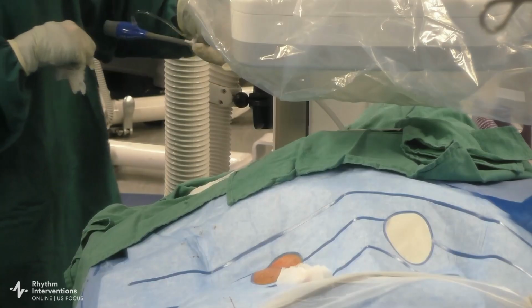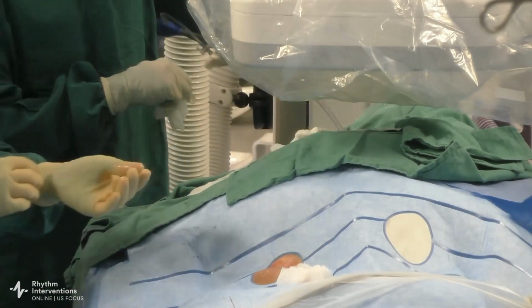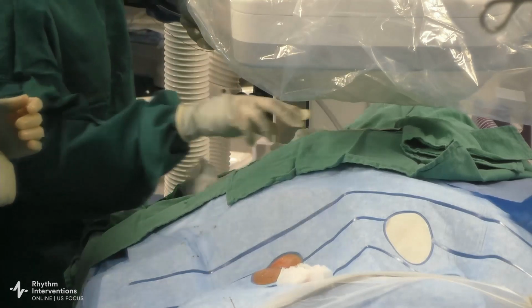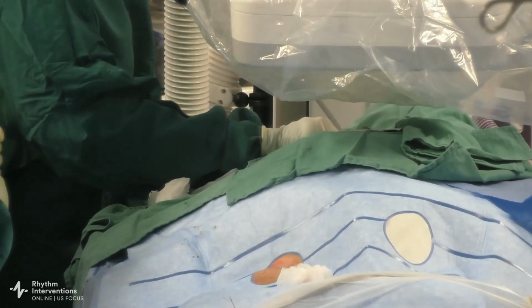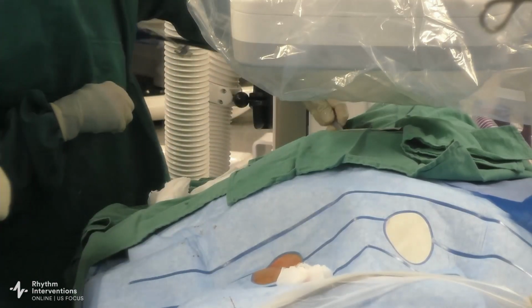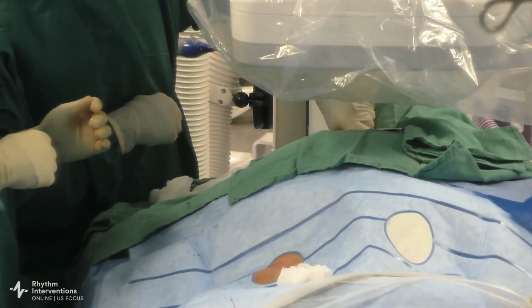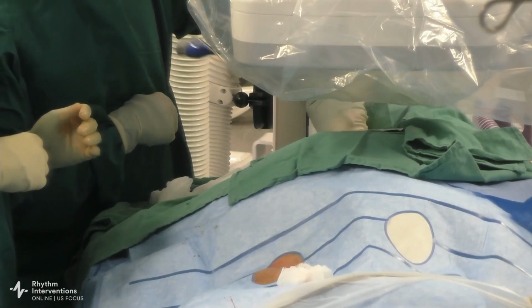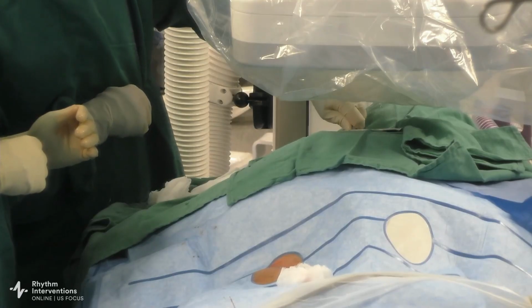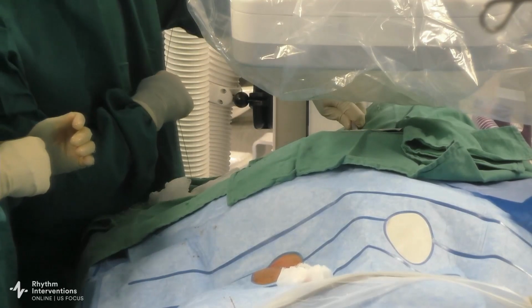Are we doing okay there? So this is a bit harder than normal, by the way, but it's good to show. He has to wait for me. All right, Flora. So this is a bit tougher than I'm used to, but at least we got it down.